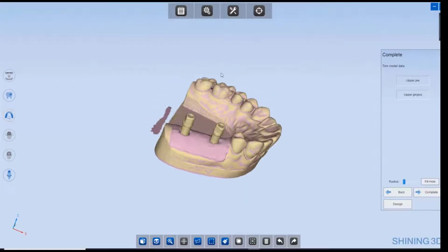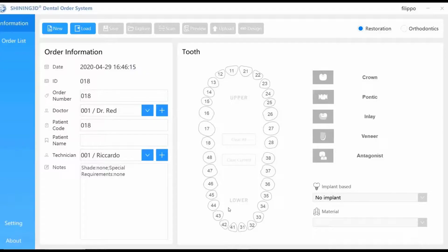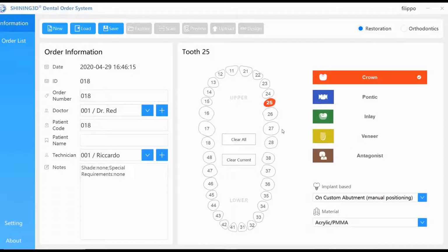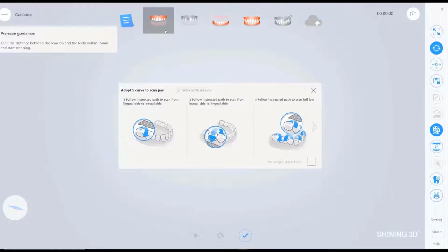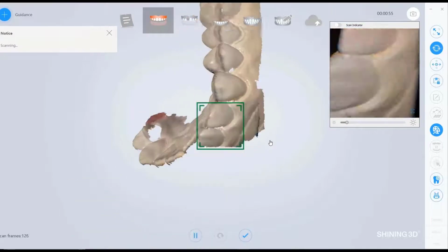As I told you before, now I would like to set the same job with the intraoral scanner. I did a time lapse related to the acquisition because I would like to pass the STL to Simone in order to study the differences between the two surfaces.